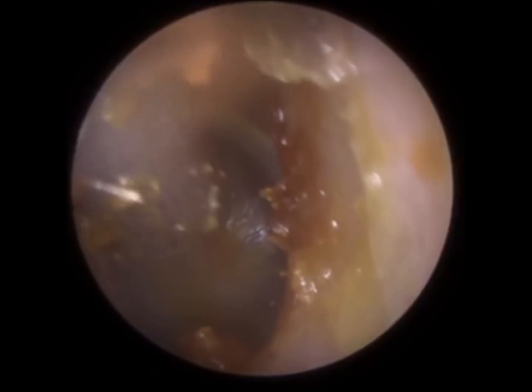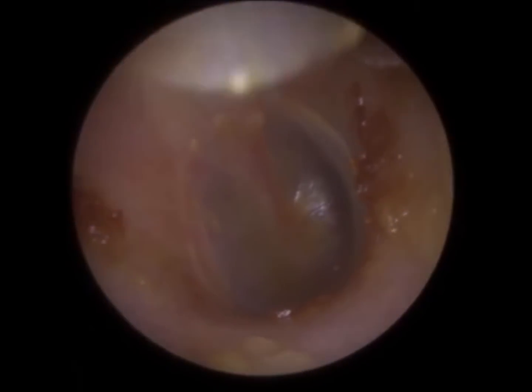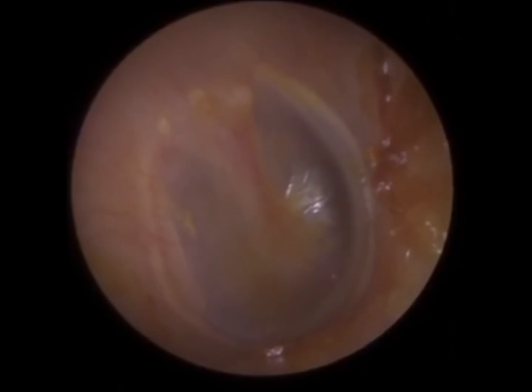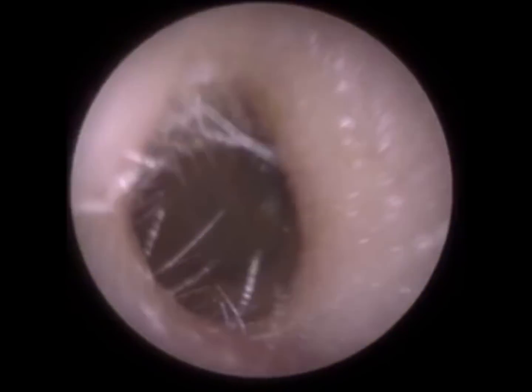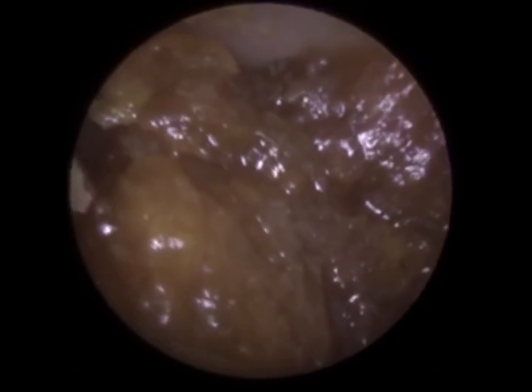Patient's quite steady, but again, I'm just being very cautious, ready to move, and for me that was it. I don't want to do any more. In real terms, even if the patient didn't have Parkinson's, I would have left that wax on the anterior canal wall. It's so insignificant.